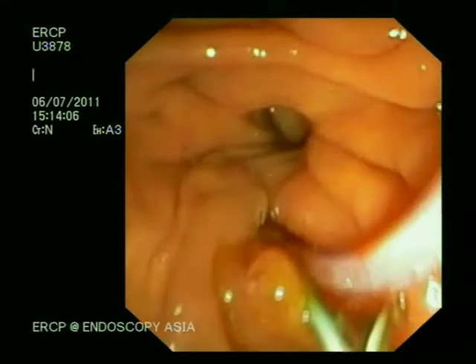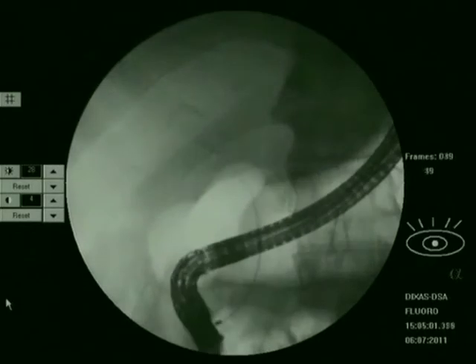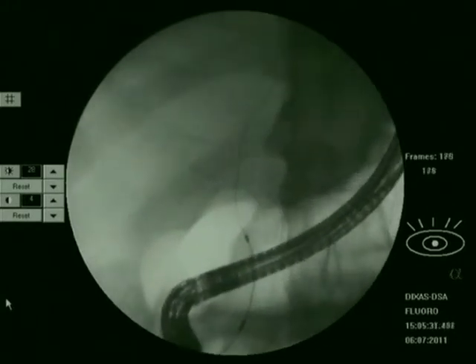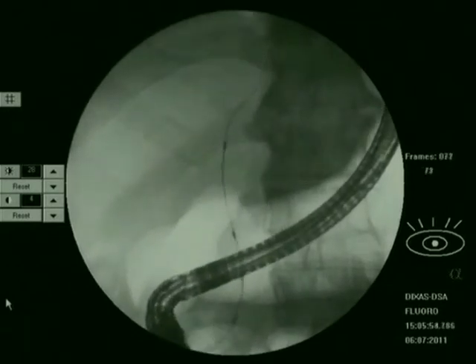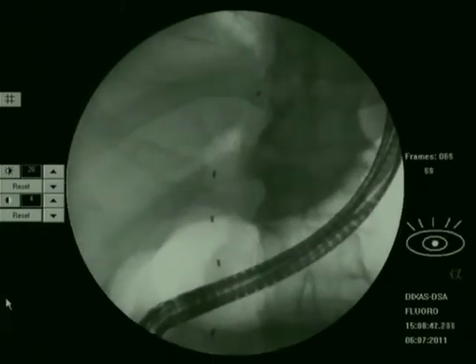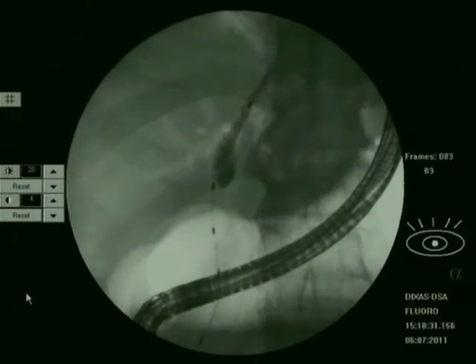That's our target of procedure this time, because we have a fair degree of idea on EUS. So now with a catheter, we are trying to put a Terumo, and as you can see, with some maneuver, we are able to cross the stricture and go into the left hepatic duct. Our catheter with push, a tapered catheter of 6 French, was able to pass, and you can see an air cholangiogram, which is showing an independent block of the left ductal system.